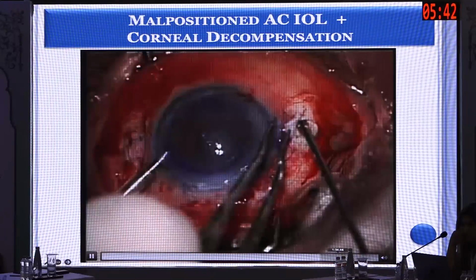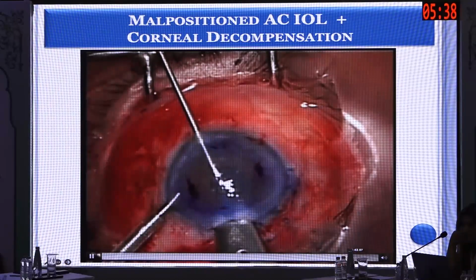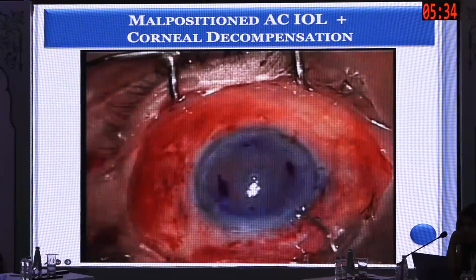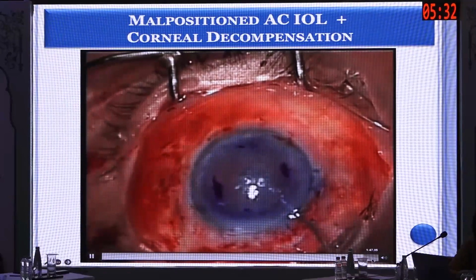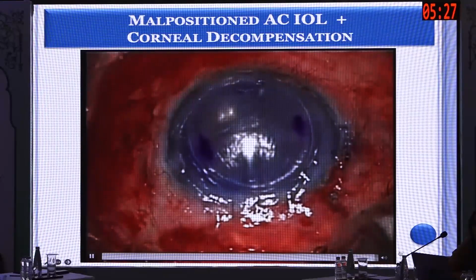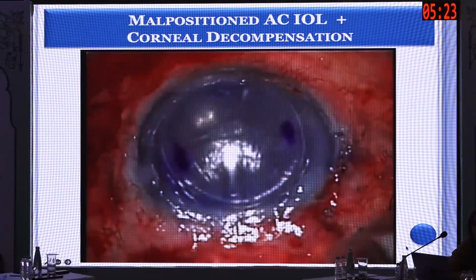It is tucked into the groove, and then this DSEK lenticule is being introduced, and so it not only provides a centered IOL but also improves the clarity of the cornea. And what I have felt so far is that even with the PMMA haptic, when you are doing a glued IOL technique, you don't have any kink or any problem.